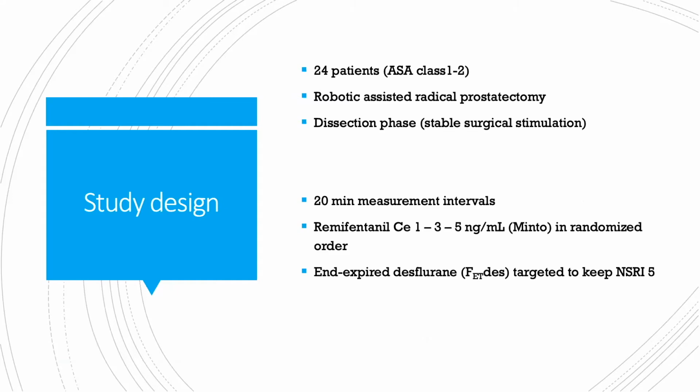In between different COVID waves, we managed to get informed consent from 24 patients scheduled for robotic-assisted radical prostatectomy. We used the Zeus anesthesia workstation from Draeger with the Smart Pilot View software installed. And we planned for each patient during the dissection phase 3 20-minute measurement intervals.